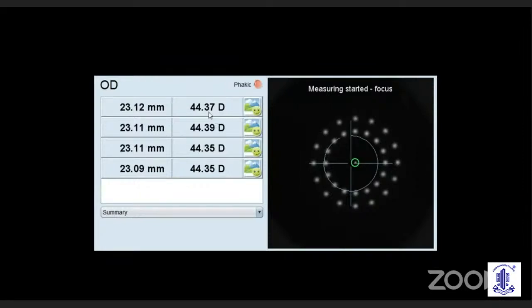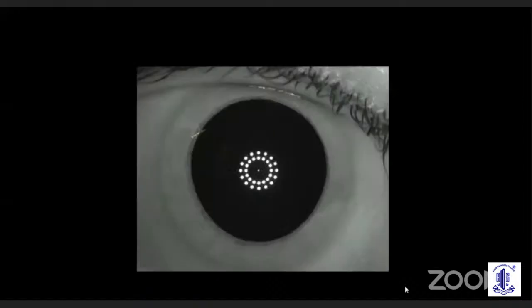But if you are not doing it, if you are only getting the calculation sheet, we ophthalmic surgeons frequently accept without any question the corneal curvature powers, the values that we obtain. But see here, we don't have any validation points for the keratometry. So there are two windows. One is the calculation window, next is the measurement window. I recommend everyone to go back to the measurement window and check for the standard deviation. It is always important to check for the standard deviation, and below it you can check the image quality as such. Only if the standard deviation is good and the image quality is good, proceed on to choosing your IOL.